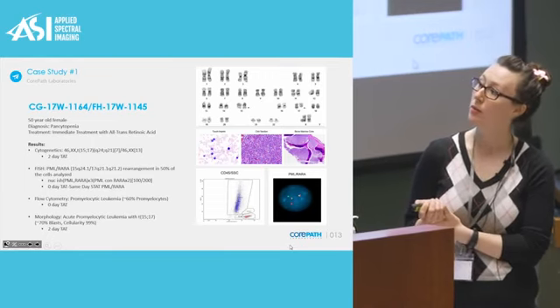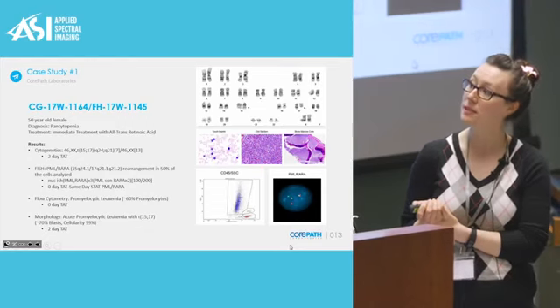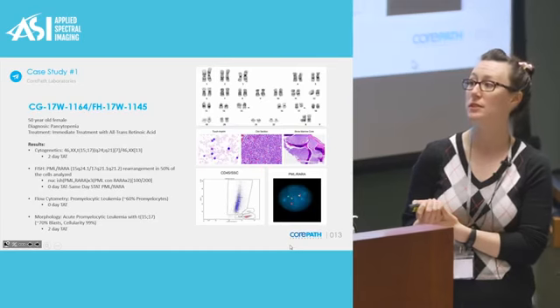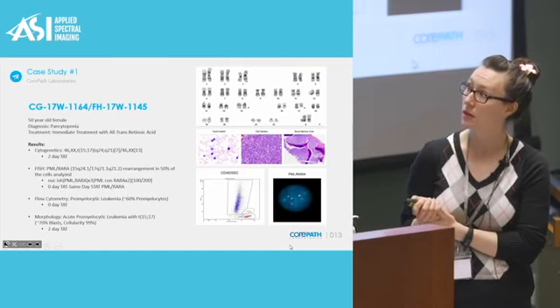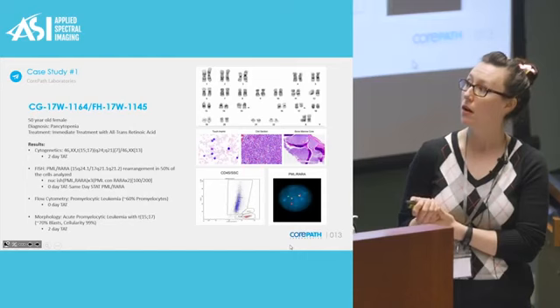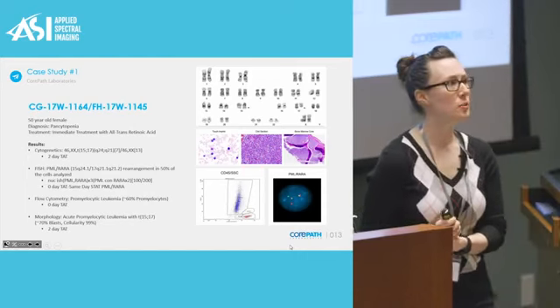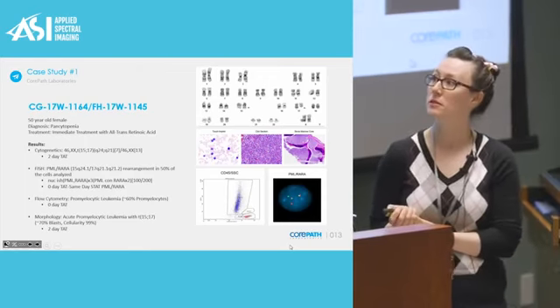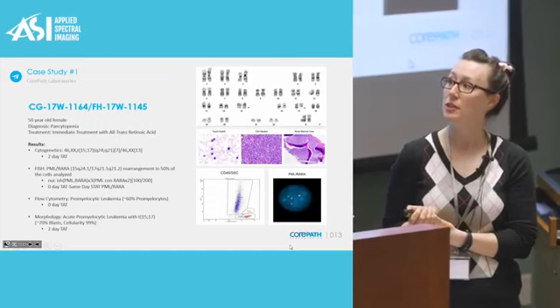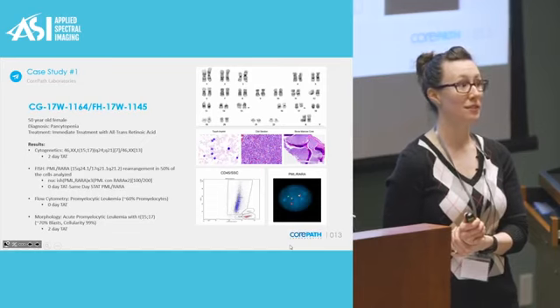And our morphology testing also had a result of acute promyelocytic leukemia with a translocation 15;17, 70% blasts with 99% cellularity. Those results came out in 2 days. And that's what our histology results look like. So that's pretty impressive. And this is an important result, as you guys probably have learned about, because this resulted in this patient having treatment the same evening with all-trans retinoic acid.